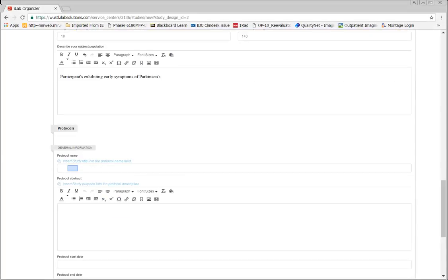Here you can track specific protocol information for your project. If the protocol name is similar to the project name, you can simply click the blue text above the bar.